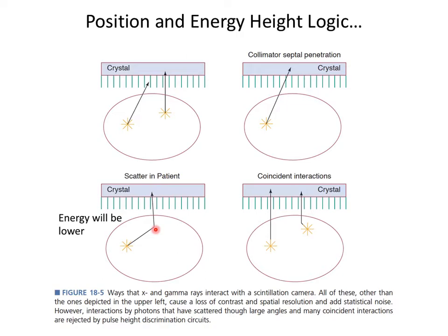So you just have a little crystal. So we had a sample like this. It had some nuclear thing in there, and then we had a sodium iodide crystal here, and events would happen and cause a flash, and then we had a PMT here.